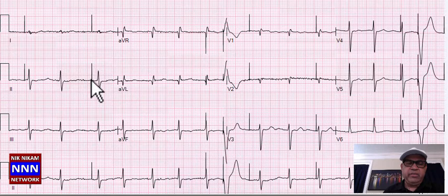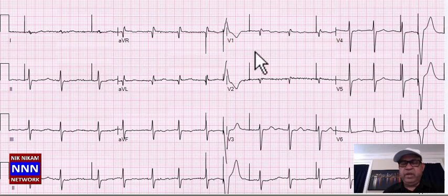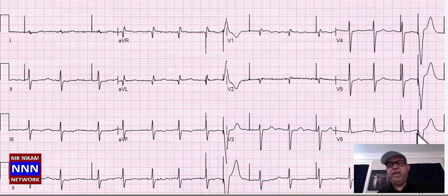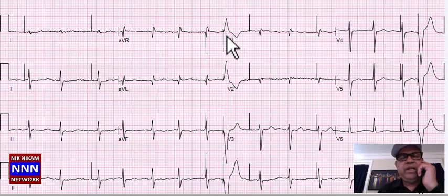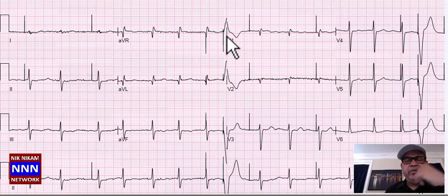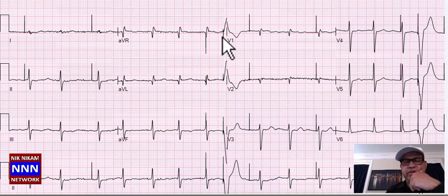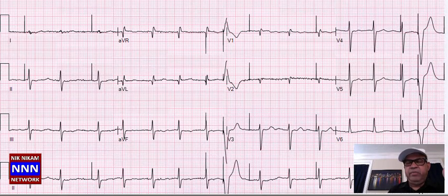Here we have something new — pacemaker spikes. This spike is before the QRS complex — atrial pacing with ventricular sensing. So the QRS complexes remain narrow, but occasionally when the ventricles don't kick in, you can have a paced ventricular beat. Here also we see atrial pacing and ventricular pacing. This is an electronic pacemaker with atrial pacing, ventricular capture, along with some occasional ventricular paced beats.